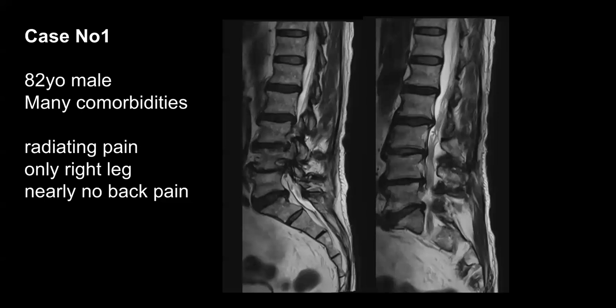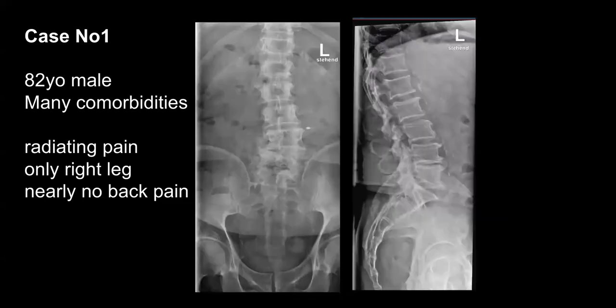You can see here the sagittal T2. And I was just highlighting here on the left image the foraminal stenosis L45. And this was my thought when I was examining the patient, listening to his story. This is maybe symptomatic foraminal stenosis L45. But you see, the X-ray shows you not more than a foraminal stenosis. He's got a flat back. He has got some coronal deformity, mainly in L45. And you see the right side is a lot narrower than the left side.